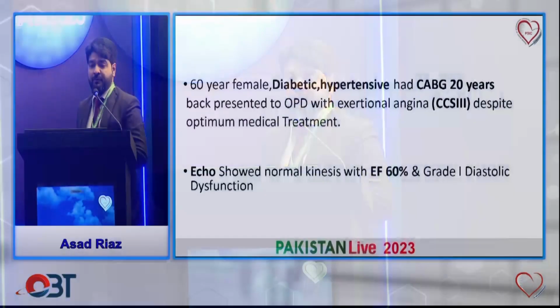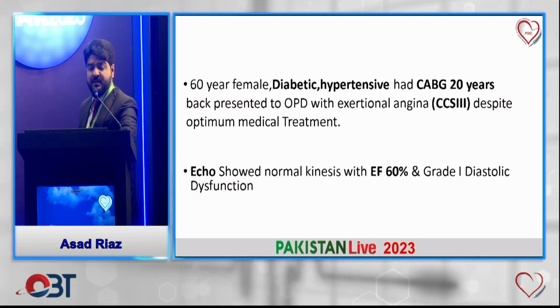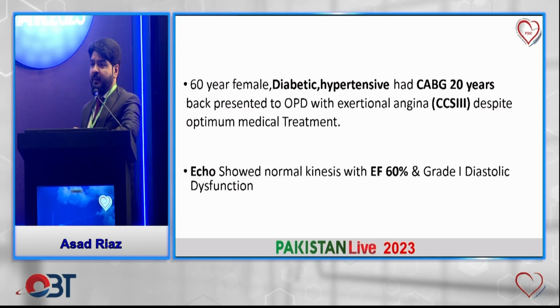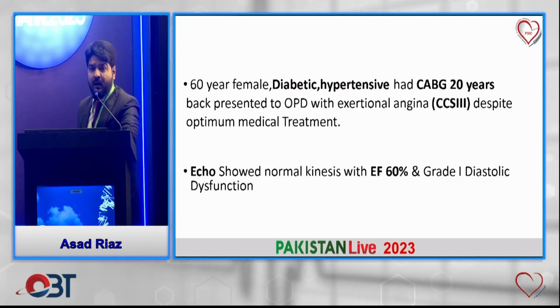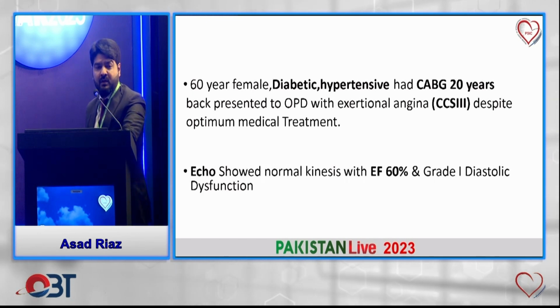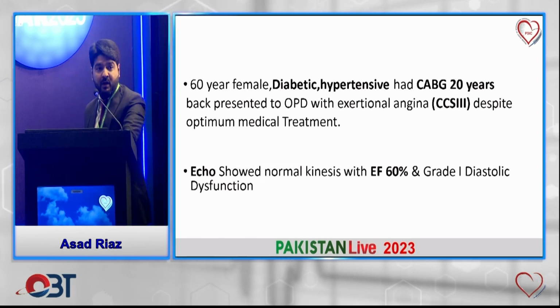We have a 60-year-old female, diabetic, hypertensive, who had coronary artery bypass graft 20 years back. She presented to OPD with complaint of angina class 3 despite optimal medical treatment. We did the echocardiogram, which showed normal kinesis.